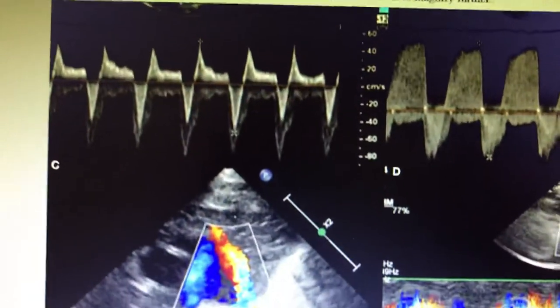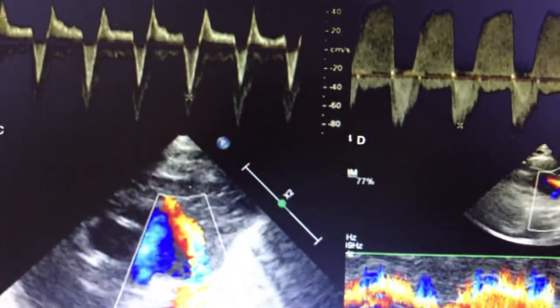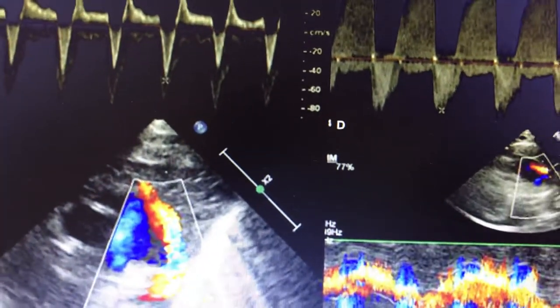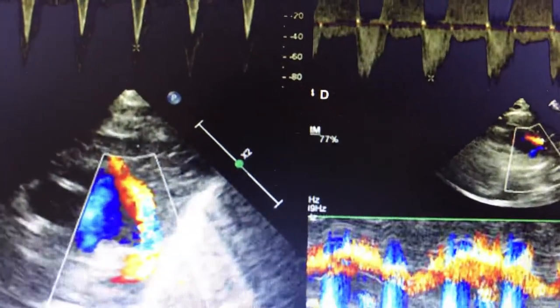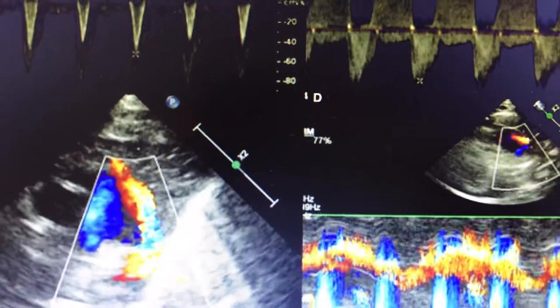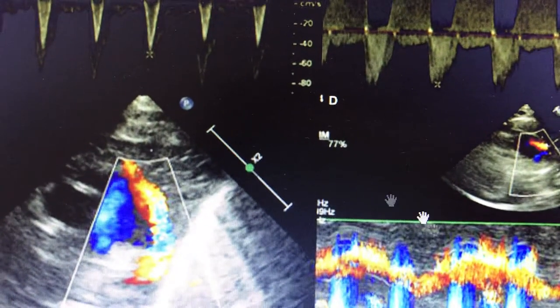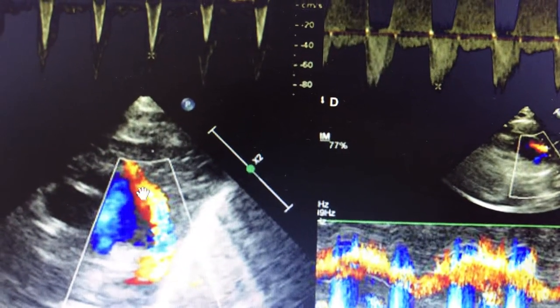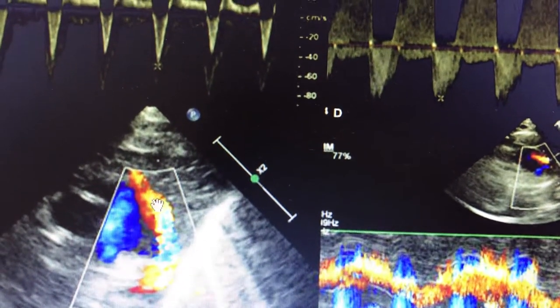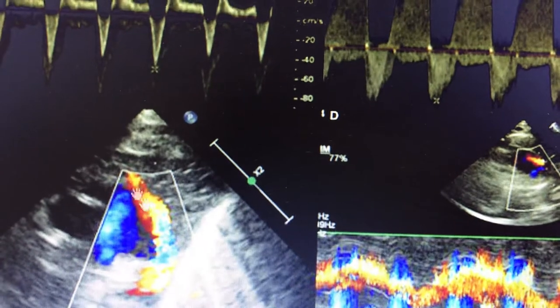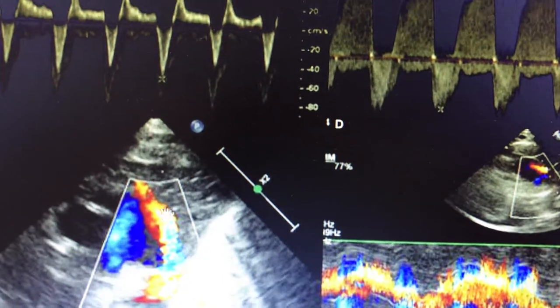This is what the actual PDA looks like — that is a left-to-right shunt or bidirectional shunt. Here you can see that there is a red flow across the PDA and it is coming towards the pulmonary artery.